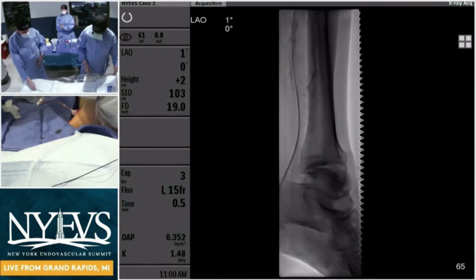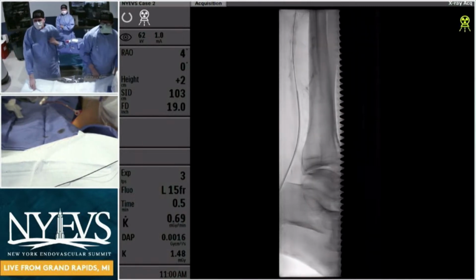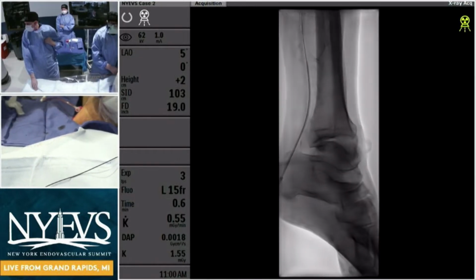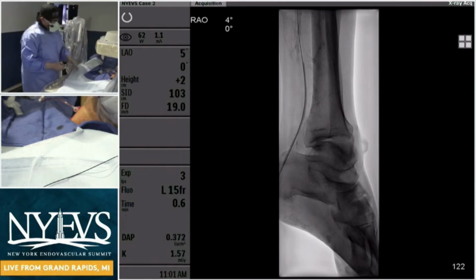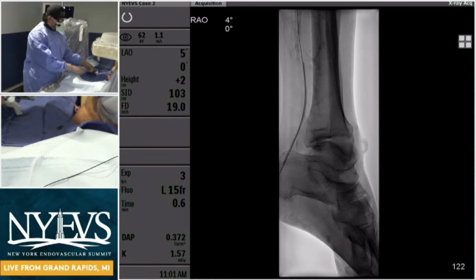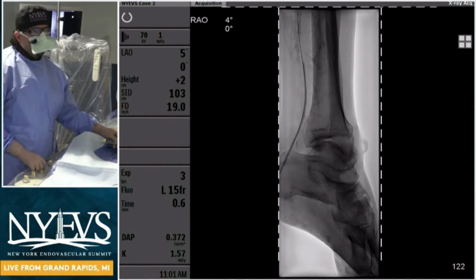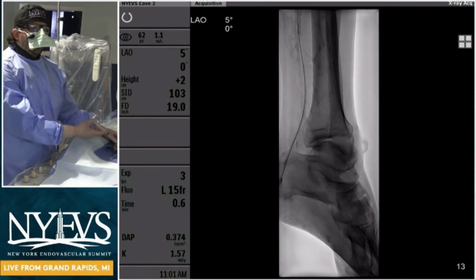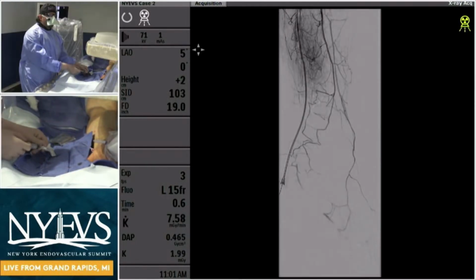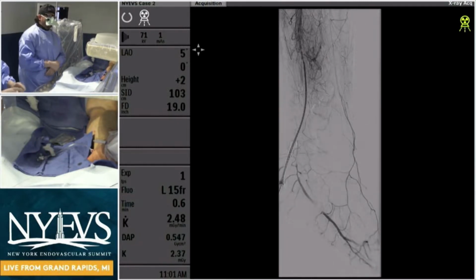As you know, PK, we depend heavily on our ultrasonography. So I don't know if you guys noticed or not, but the size of the posterior tibial artery distally was about 3.5 millimeters, which is, in my experience, a large size for distal posterior tibial artery that's underfilled. That's one thing. The other thing that we do with the TAMI technique, which is pedal-based revascularization, we use ultrasound-guided closure, meaning using the hockey stick probe to basically occlude our access site and allow patent hemostasis.